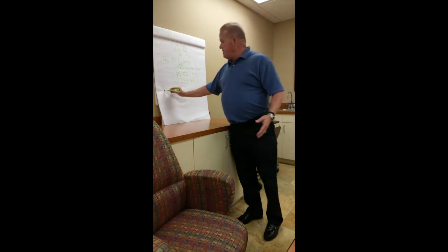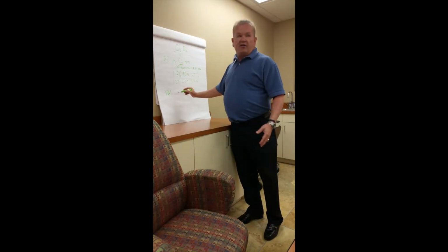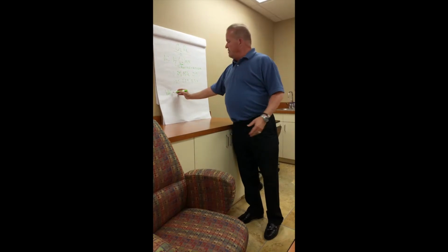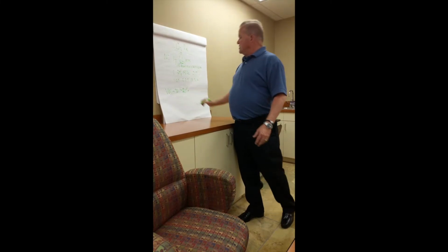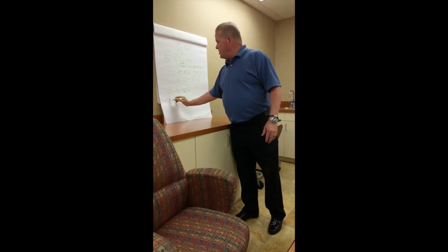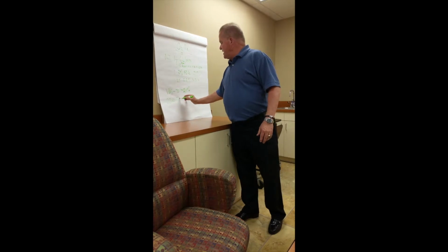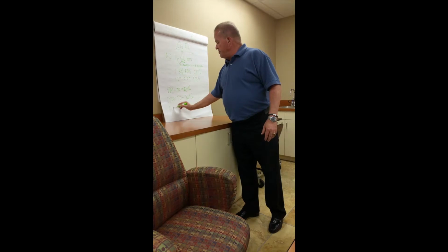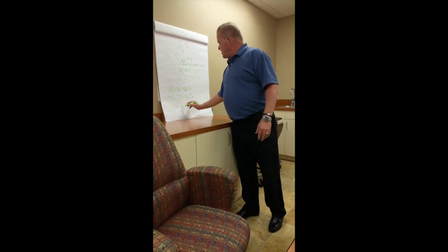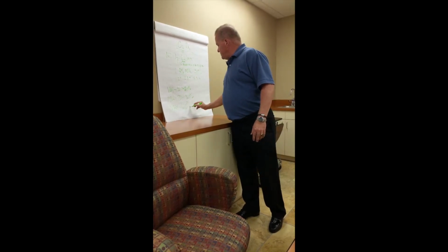Okay? Venturi mask starts, unless you want to dial in, they have 28%, etc., but typically 40% up to 70 or 60%. Okay? Then we have partial rebreather masks, 70% to about 80%. And finally, non-rebreather masks at 100% if you have a tight fit.